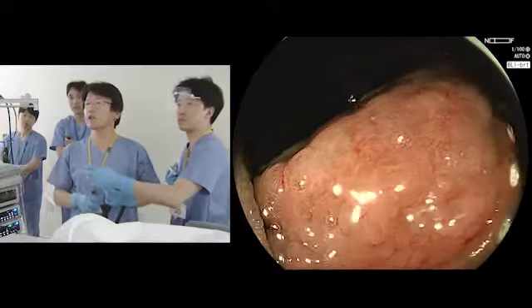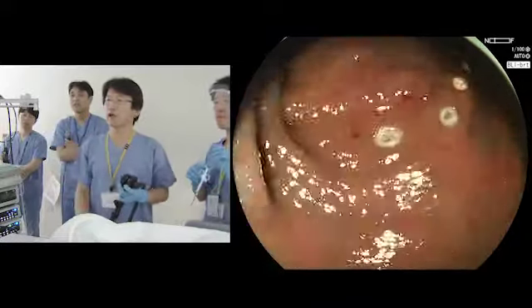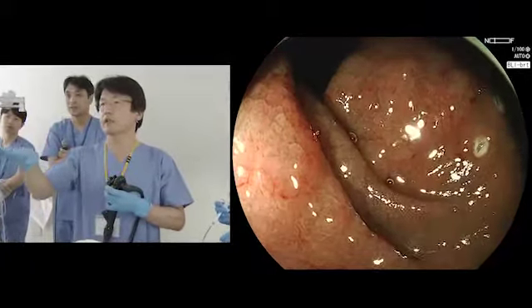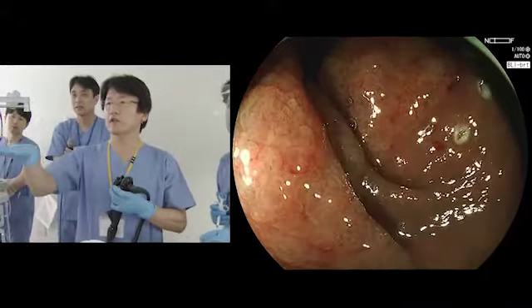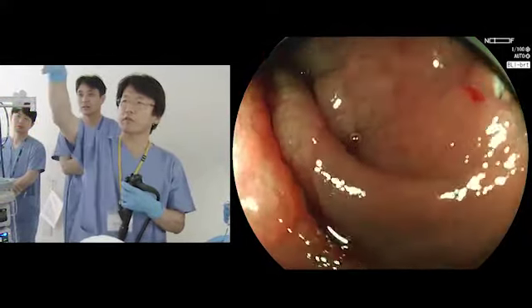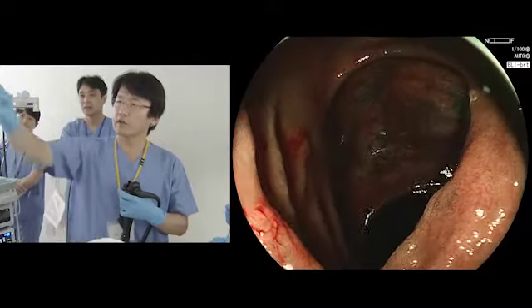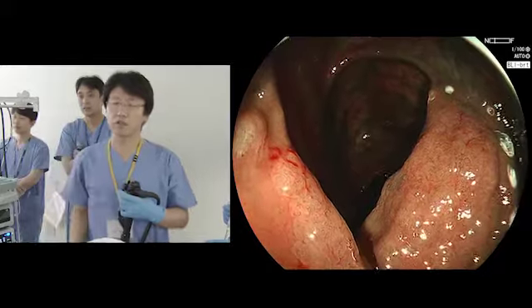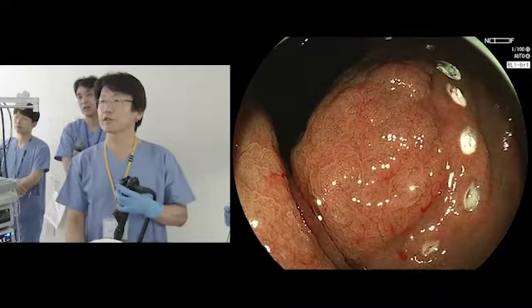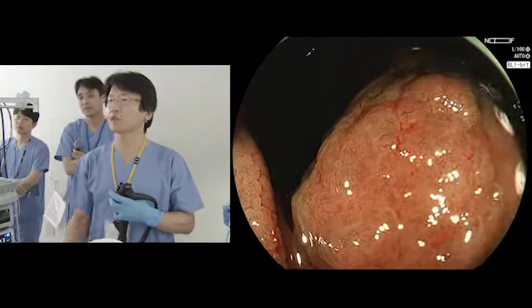Yes. After making a marking, I will change to the short double balloon endoscope with ST hood. And then I will probably make a pocket from here, as tangential as possible, and then go into the submucosal space. And in the pocket, I can lift up the mucosal side and go up the fold, and then press down the fold and go down to the other side. So in that way, hopefully I can dissect the submucosal tissue under the lesion, even if this lesion is located on the prominent fold.